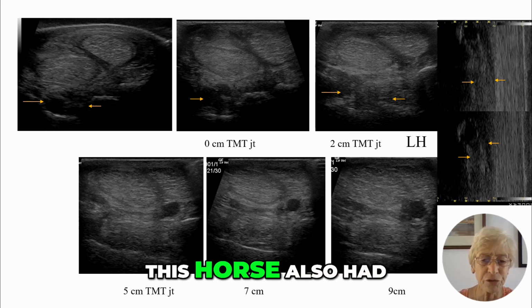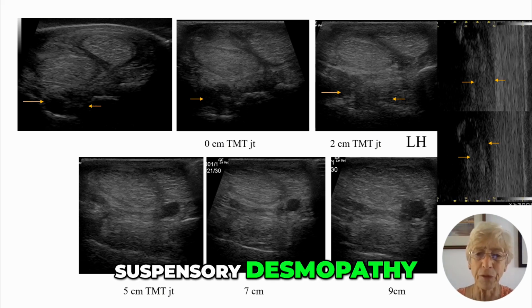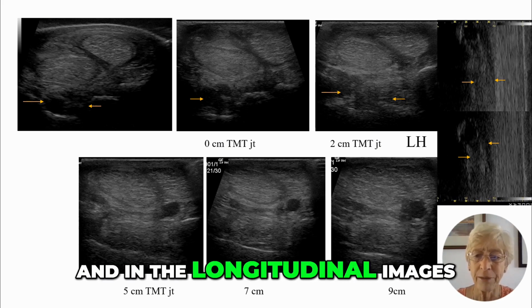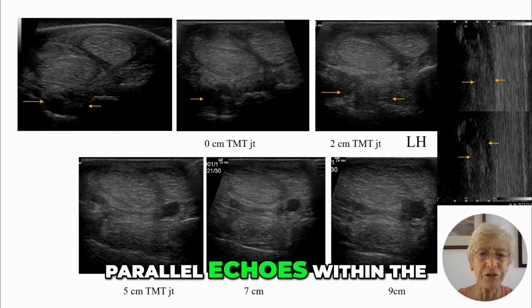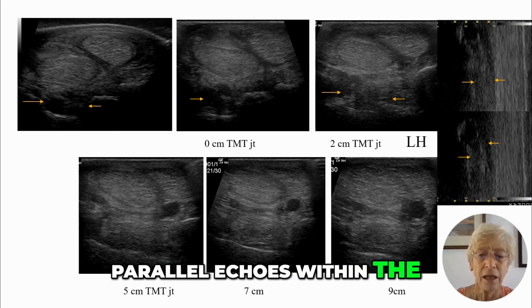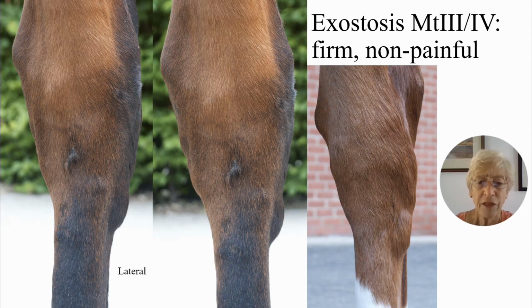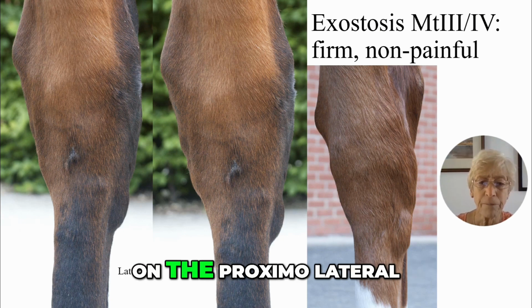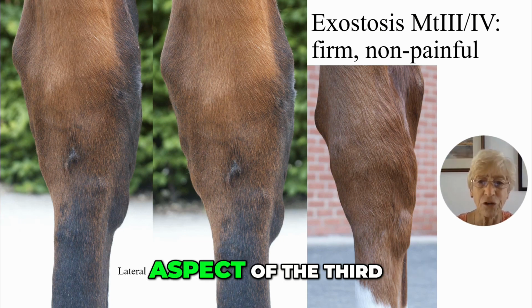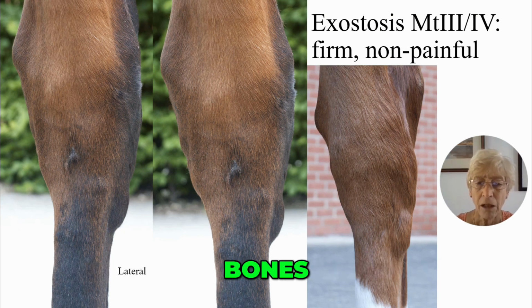In addition, this horse also had evidence of mild proximal suspensory desmopathy. And in the longitudinal images, we can see the loss of long linear parallel echoes within the accessory ligament of the suspensory ligament.